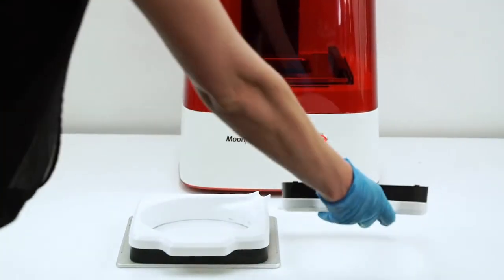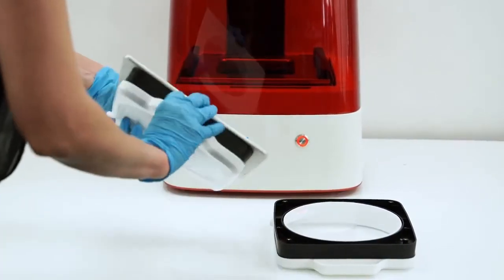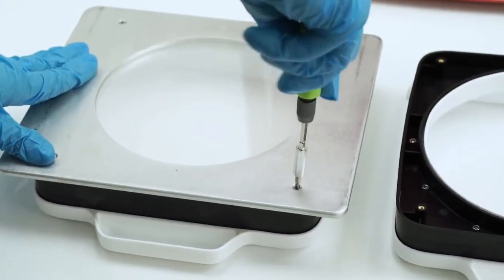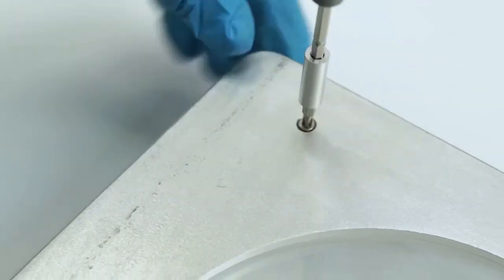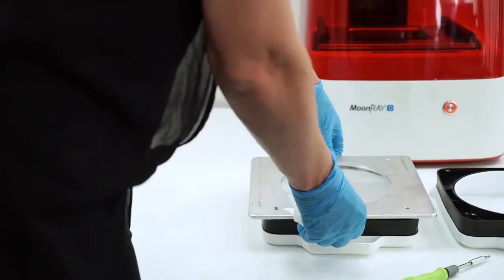Eventually, you'll need to replace your resin tank by placing a new resin drum onto your metal resin tank assembly base. Moonray resin drums can last for use with up to 50 liters of resin, but may need to be replaced earlier. Place the old resin tank and the new resin drum upside down on a flat surface and begin removing the 4 screws on the bottom of the resin tank assembly.